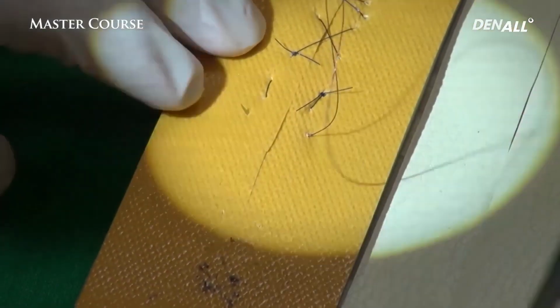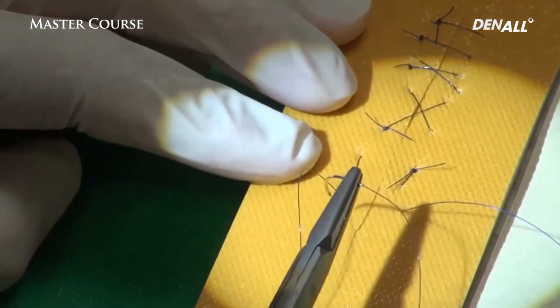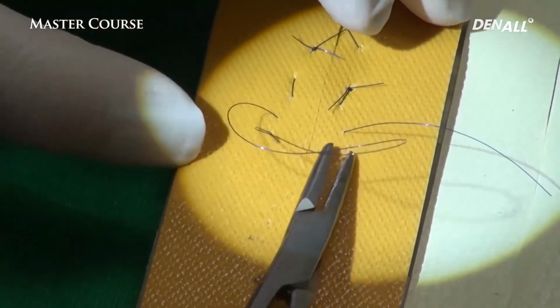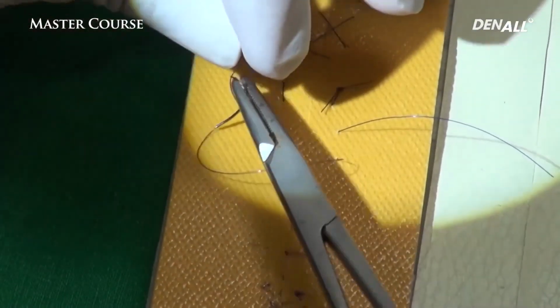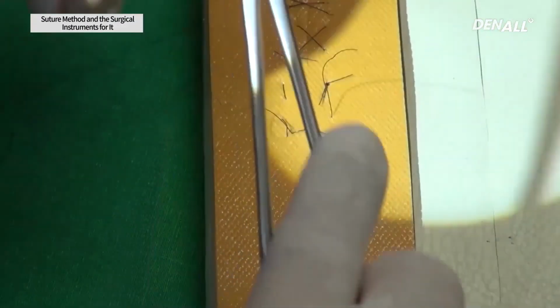So from the buccal to the lingual, and then from the lingual you go in again, and again go out through the buccal side. If you suture here, the horizontal internal mattress suture is what you have done. But here again, you do a knot and the needle goes from inside to the outside, it goes out.